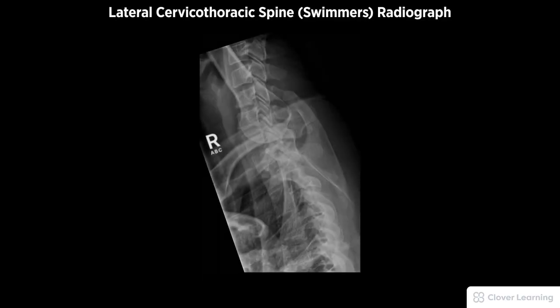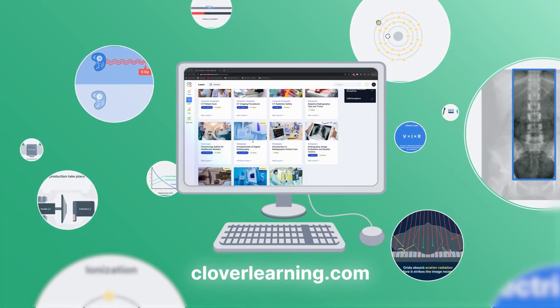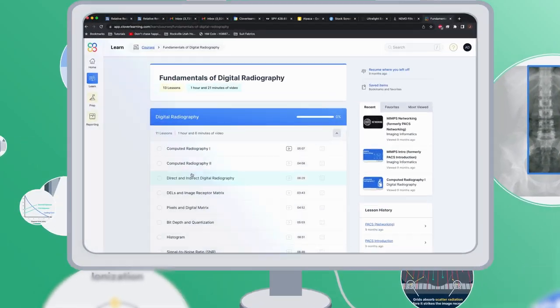A diagnostic lateral cervical-thoracic spine or swimmer's view must be free of motion and rotation, with adequate penetration through the shoulder region. Demonstrated anatomy includes the lower cervical and upper thoracic vertebrae with proper visualization of soft tissue and bony detail.